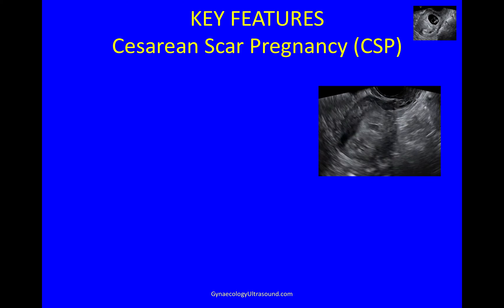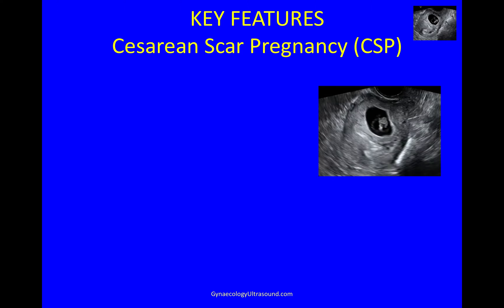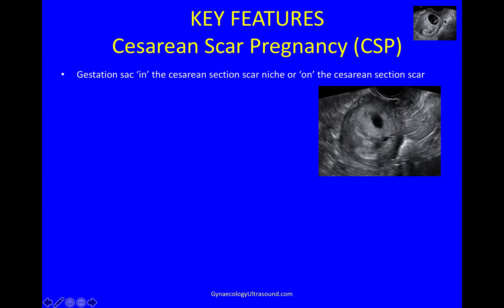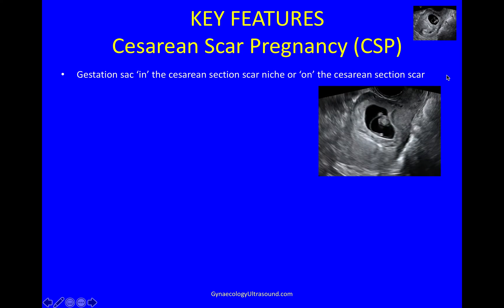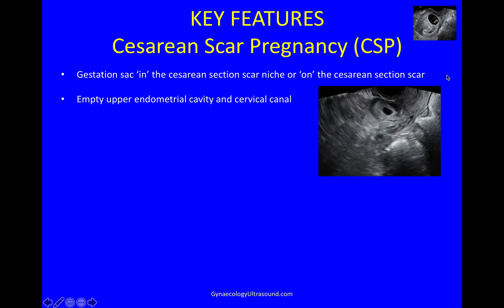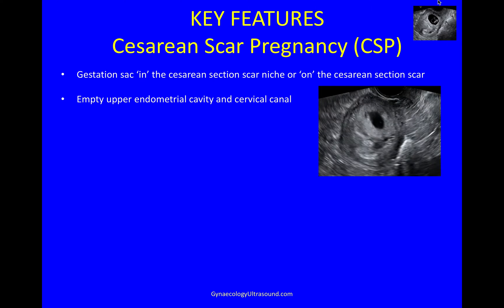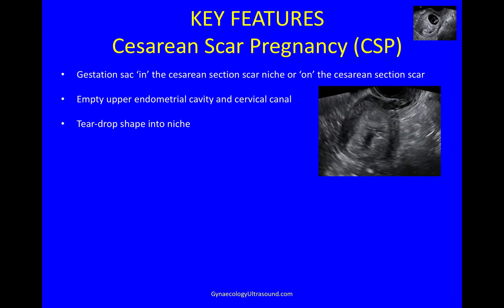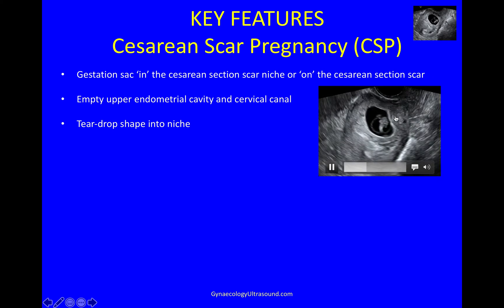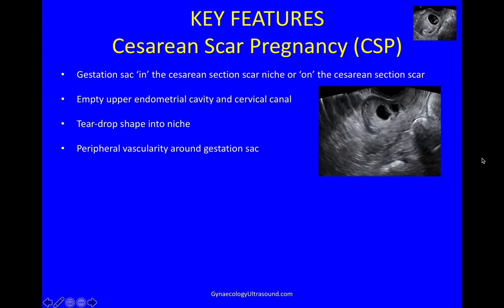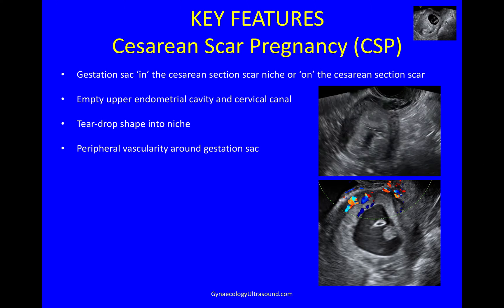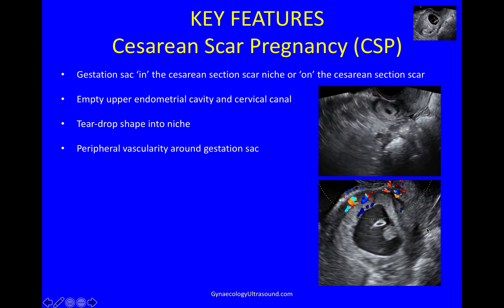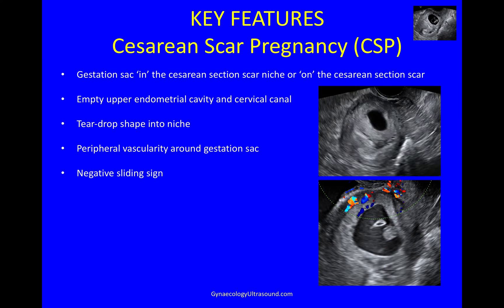In cesarean scar pregnancies the diagnosis is made on 2D: the gestation sac is deeply embedded within the cesarean niche, or implanted on top of the cesarean section scar. It is diagnosed by seeing an upper empty endometrial cavity, an empty cervical canal, and sometimes at an earlier gestation the gestation sac looks teardrop-shaped into the niche. Importantly, you see peripheral vascularity around the gestation sac, confirming it is embedded in this abnormal location, with a negative sliding sign.